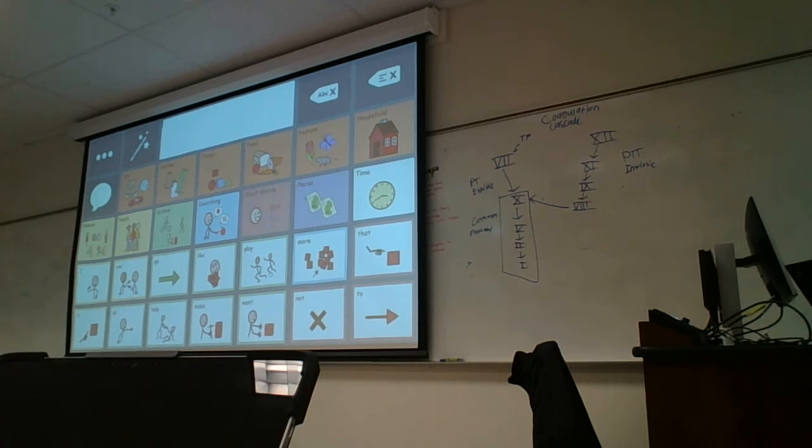You judge what your client is able to do. If they need pictures and they need text, then you would maybe start with SnapCore First, and then pick the grid size from there to see what their capabilities are. I would say SnapCore First, for the symbol-based communication page sets or any of them, is a little bit more intuitive in terms of programming. It's a little bit easier. You go to that edit button, change it. Sometimes Communicator 5 is a little bit more complex. I used Communicator 5 with some of my students in the past because SnapCore First wasn't out yet, so that's what was on the devices. But I would definitely say, take a look at both and then see what works for your client.